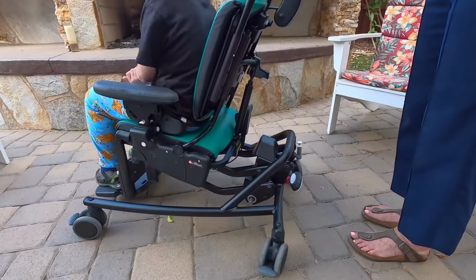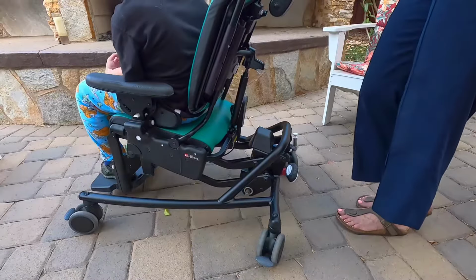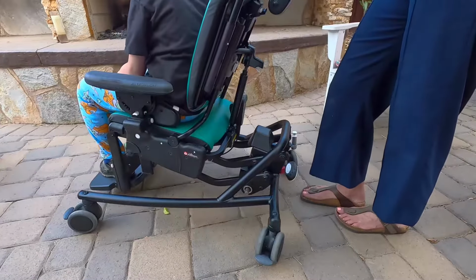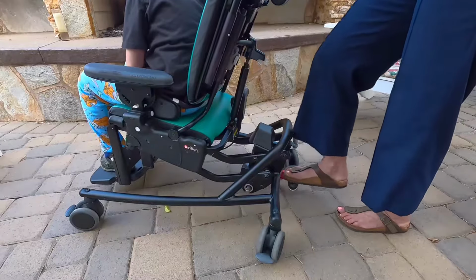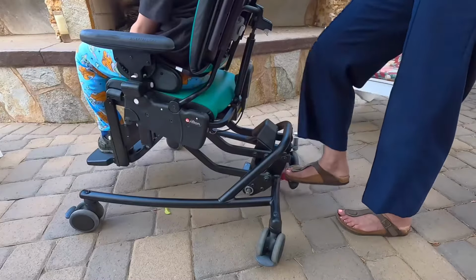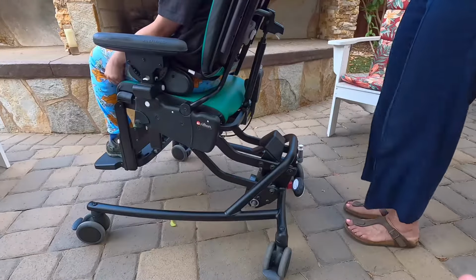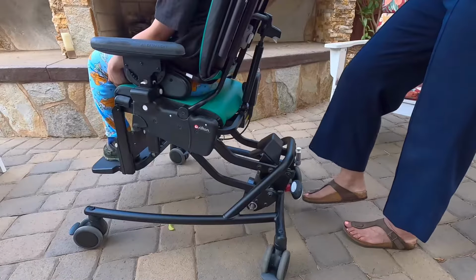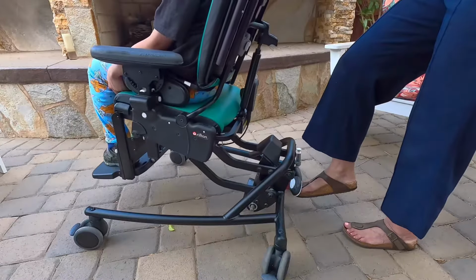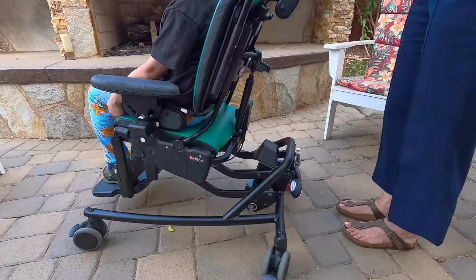So here's a demonstration, just putting down on the foot pump. Each time go ahead and pump the foot pump there. Every single time it raises the chair a certain amount, and now we will demonstrate lowering the chair to a seating position, but not lowering it all the way. So then you just lift the white part of the foot pump, the main portion.